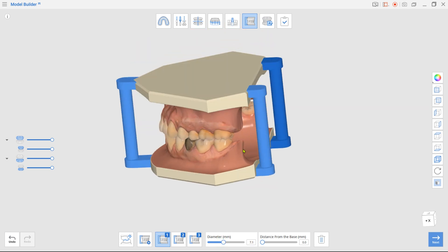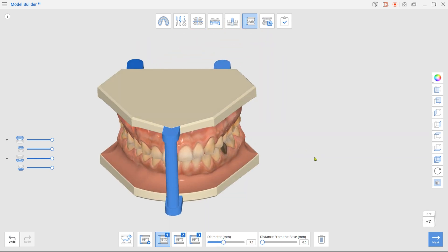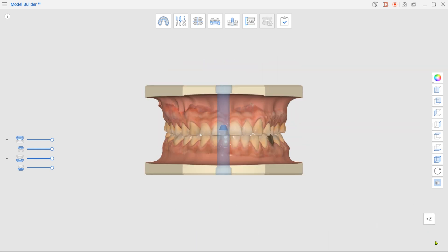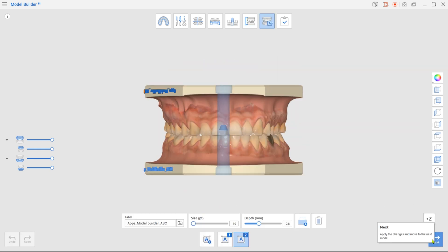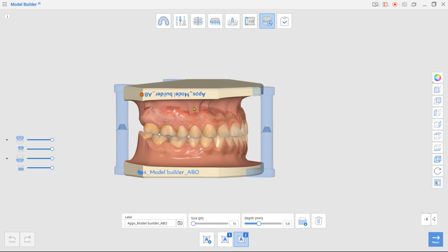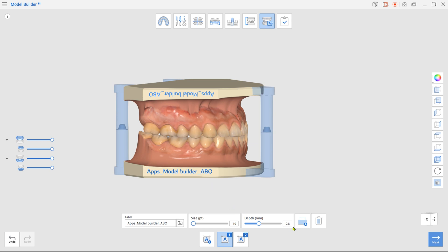Once done, move to the final labeling mode. The first label is automatically created using the case name. Drag the label to change its placement on the base. To change the label text, enter a new name in the label box below. You can choose to engrave or emboss the label.